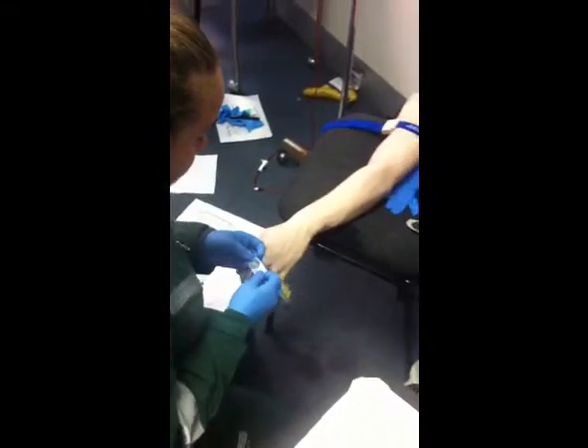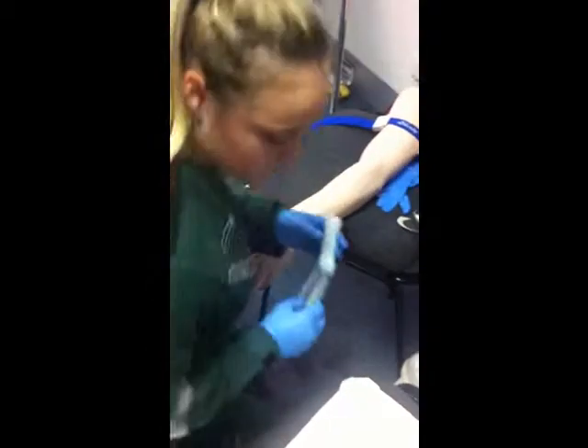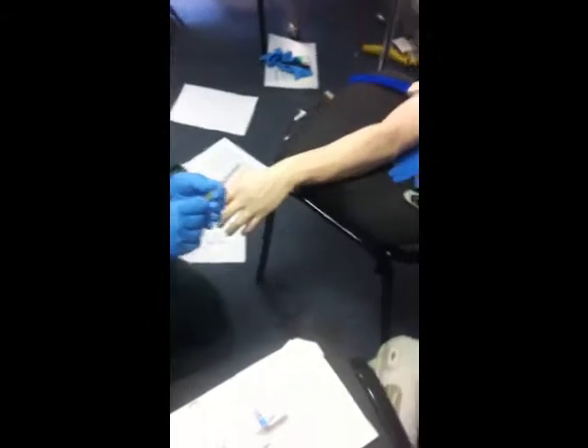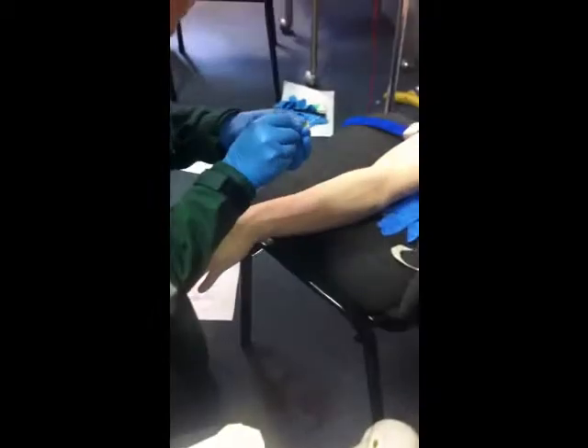So the vein is being nice and straight. You can see it. Now we're exposing it. Sharps out. So now I'm removing the cap — I'll say sharps out to everyone. So making sure. Make an example.